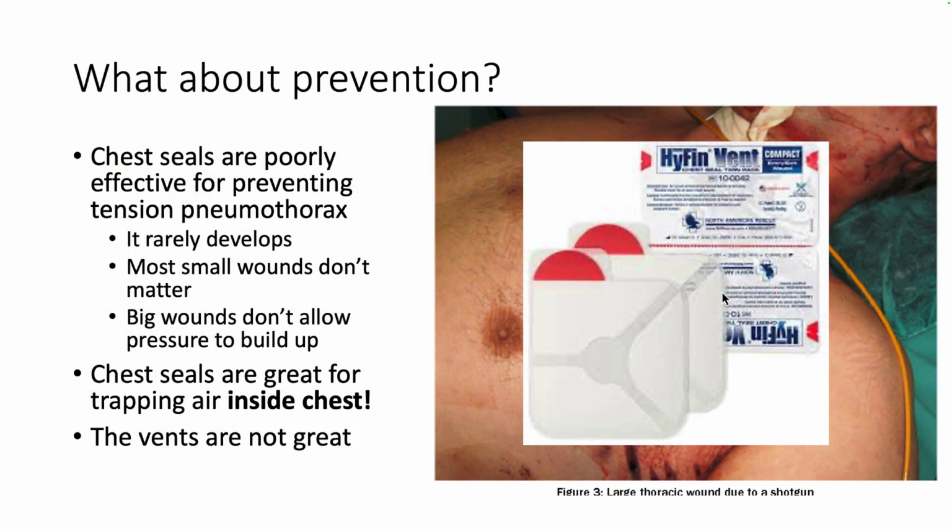So again, the weird settings aside, our normal, bread and butter trauma patients, we're going to see these very rarely because they take time to develop, and we're pretty fast at getting these people packaged up and moved to the hospital. So we'll talk about chest seals.